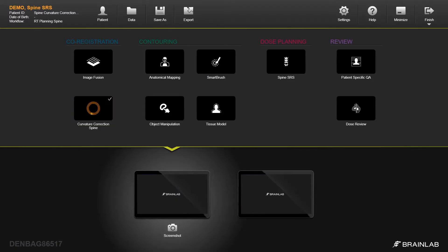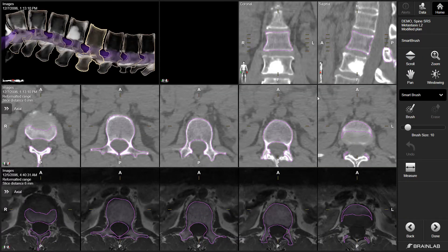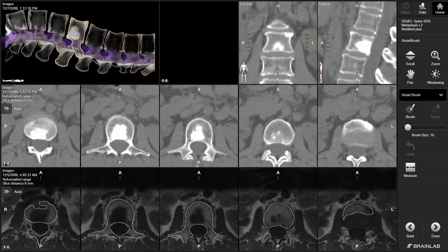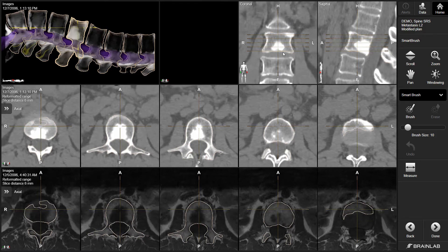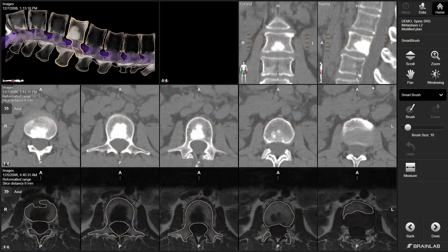Element Smart Brush Spine rapidly and consistently creates gross tumor volumes, clinical target volumes, and related organs at risk for spine SRS treatments. By selecting the affected vertebrae in the interactive 3D view, the dataset is centered on the correct vertebrae in both the CT and MR datasets. The new Parallel view gives the user the option to perform guided multi-modal contouring.